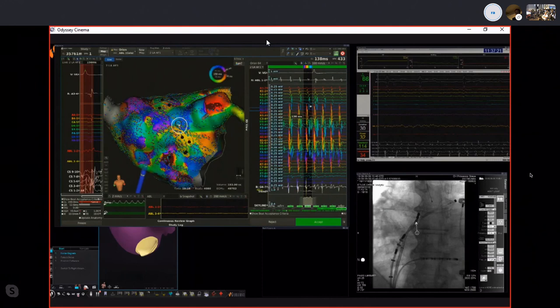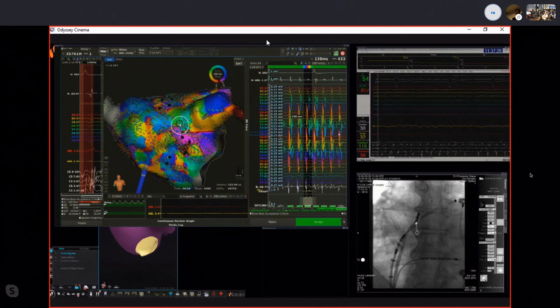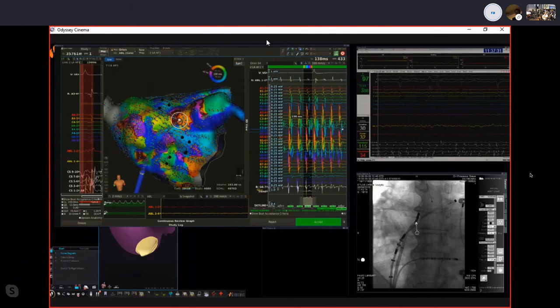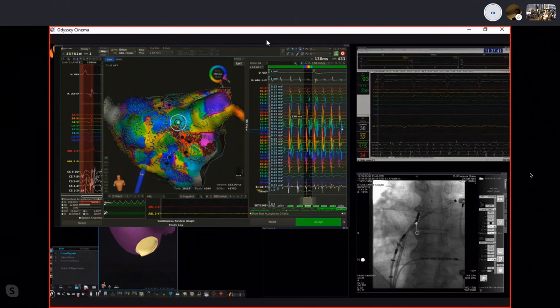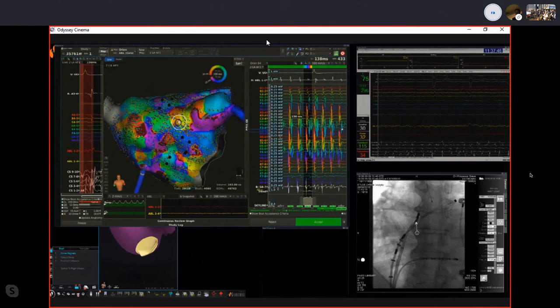Now, this is sequential mapping. Of course, afterwards the Orion catheter was moved, but we try to map the entire cavity in a very detailed way, and come back at least at all the interesting spots several times in order to see if those, let's say, rotational patterns of activation are still there a few minutes later. So we do, of course, our best.